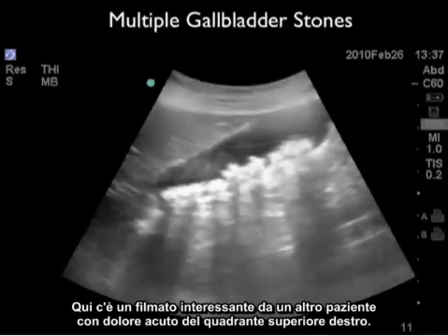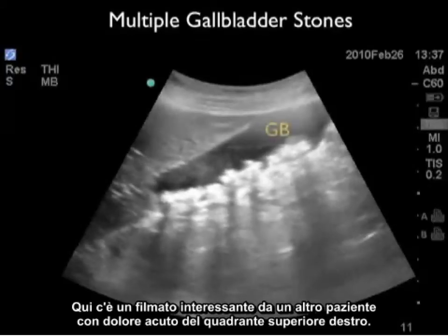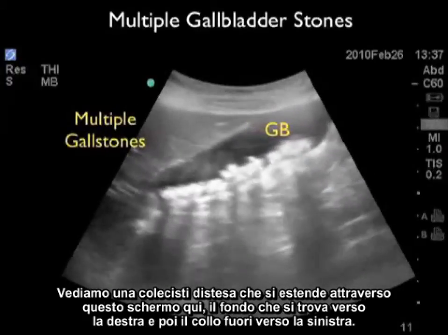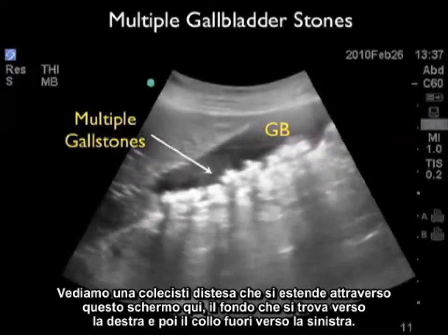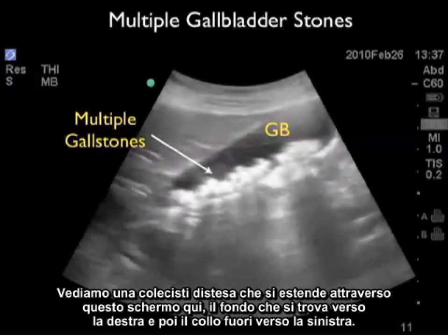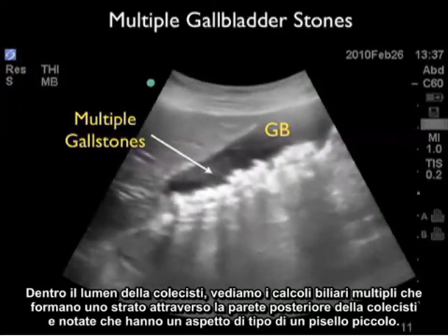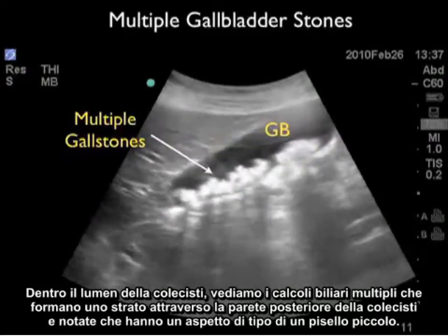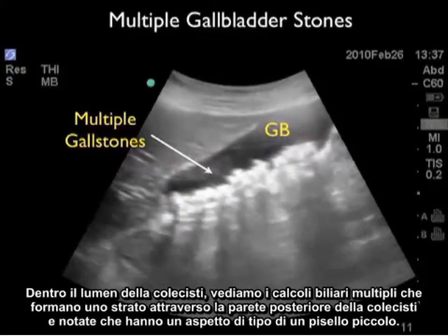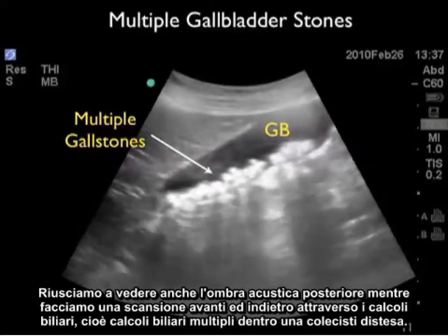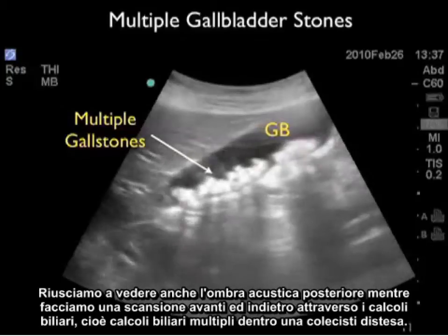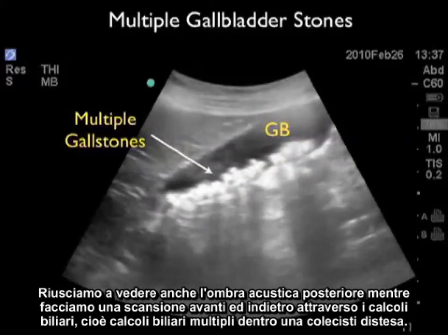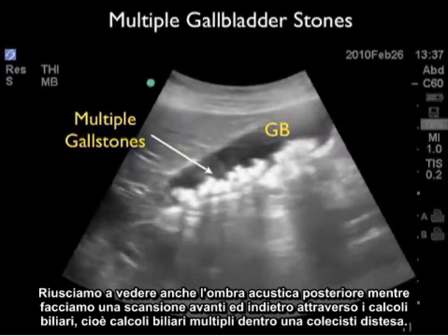Here's an interesting video clip from another patient with acute right upper quadrant pain. We see a distended gallbladder stretching across the screen, with the fundus towards the right and the neck towards the left. Within the lumen, multiple gallstones layer across the back wall with an almost small pea-like appearance. We can also see the posterior acoustic shadowing as we scan back and forth — multiple gallstones within a distended gallbladder.